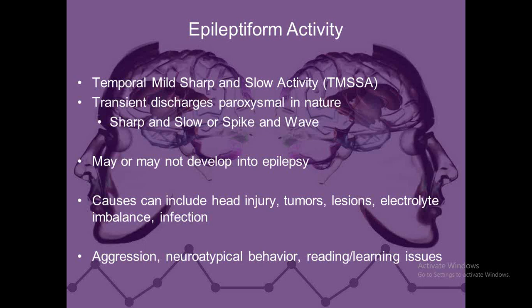Usually if it's audio or visual, it's going to be in the posterior part of the brain. If it's delusional, it's usually hitting the insular cortex, medial temporal, and there's a way to look at that, but that's, again, back to the calling of the electroencephalographer.